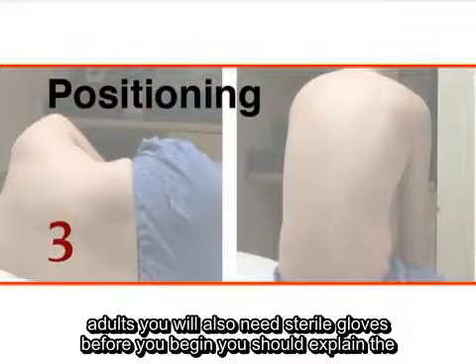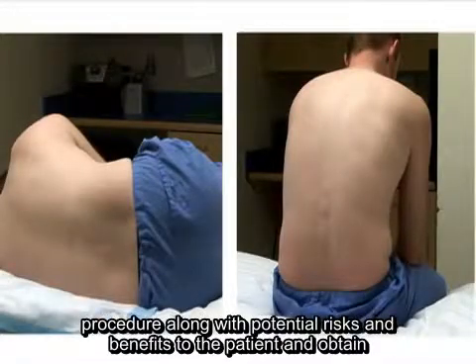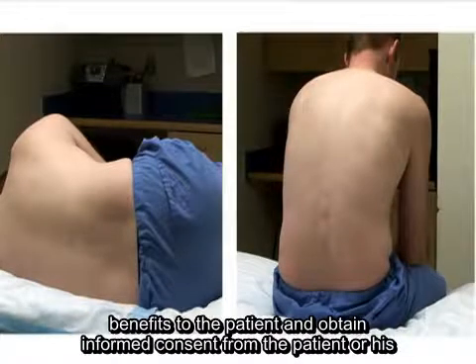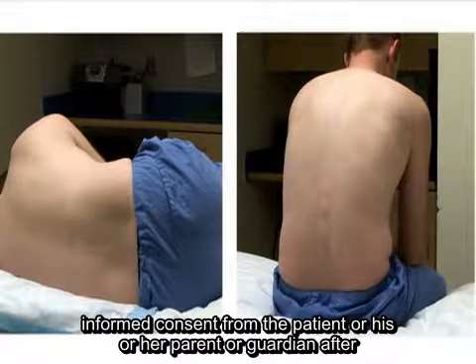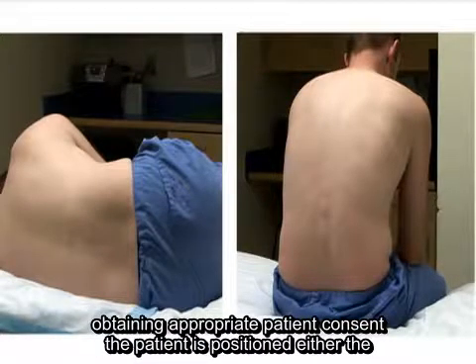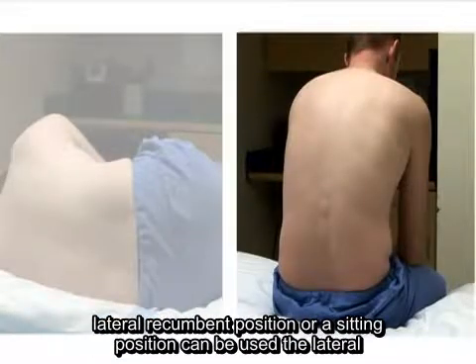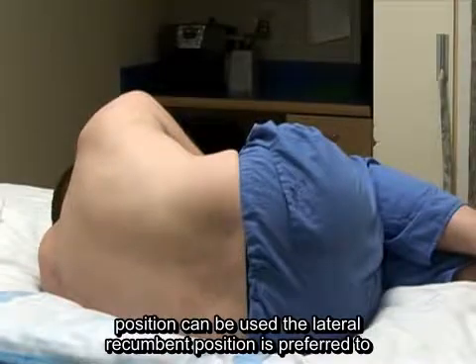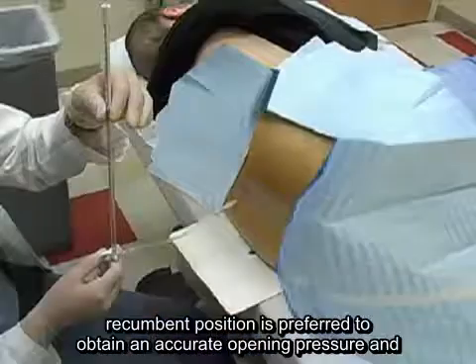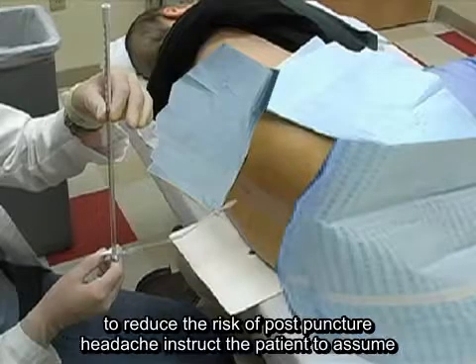Before you begin, you should explain the procedure along with potential risks and benefits to the patient and obtain informed consent from the patient or his or her parent or guardian. After obtaining appropriate patient consent, the patient is positioned. Either the lateral recumbent position or a sitting position can be used. The lateral recumbent position is preferred to obtain an accurate opening pressure and to reduce the risk of post-puncture headache.